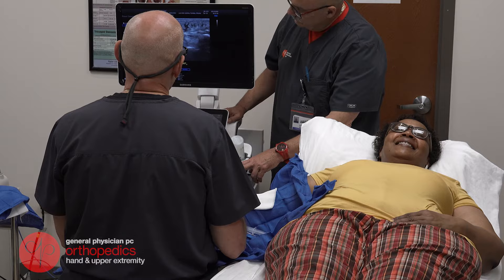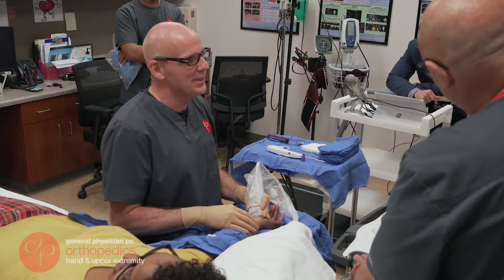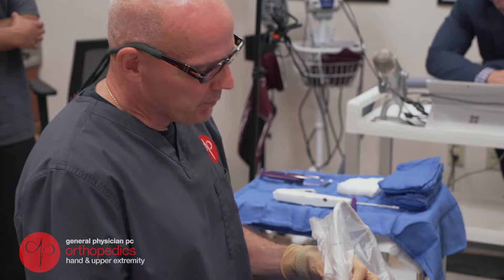The first thing that we do is an ultrasound exam of the hand and wrist. I do this to make sure that there are no abnormalities in or around the carpal tunnel that might prevent us from being able to do the procedure.